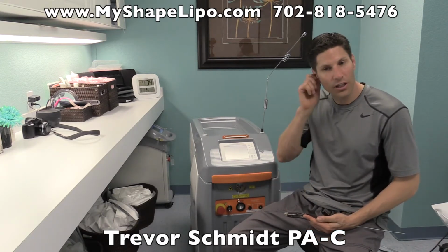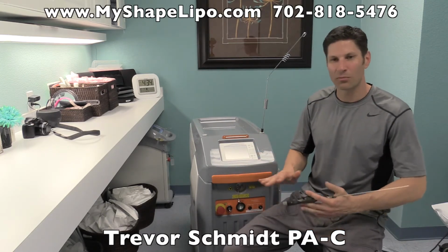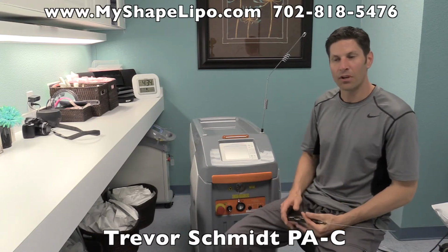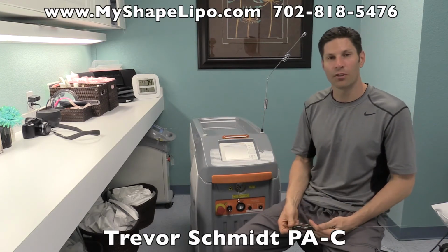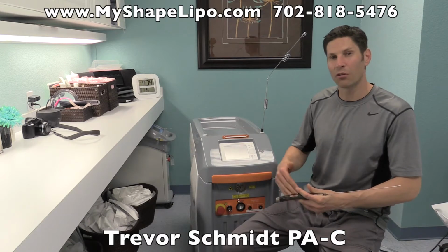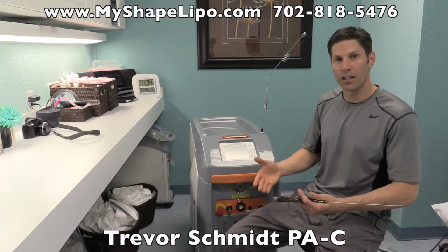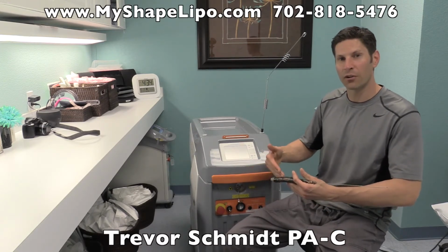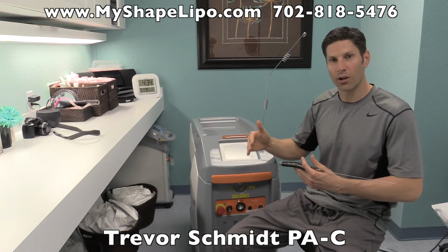The reality is, nobody needs any of these procedures. These are all elective. So it's all what you want and what you're concerned about. If you are concerned about the looseness of the skin, then the laser's the right thing for you. If you have very tight skin, you probably don't need it. It's not necessary. But if you are perhaps older, maybe in your 40s, your 50s, your 60s, these people tend to have looser skin. And things don't get better as you age, it only gets worse. So if you're concerned now with looseness of the skin, it's a good idea to address it now to hopefully have tighter, thicker skin later in life, and to slow down the aging process.